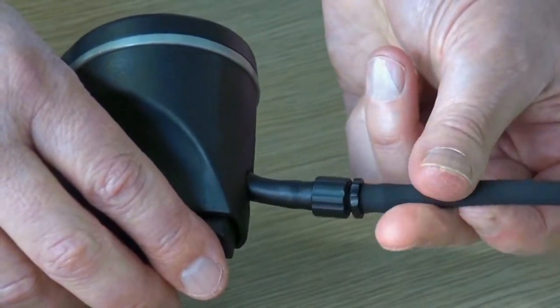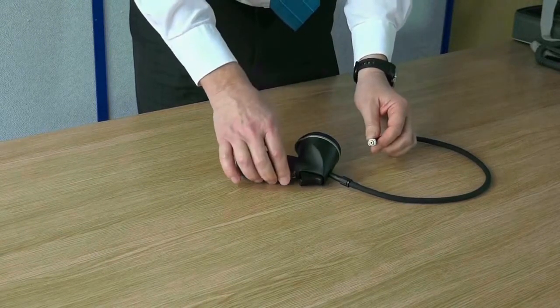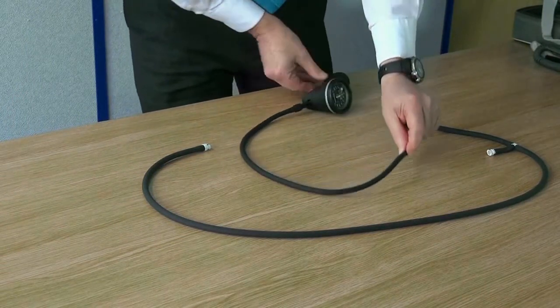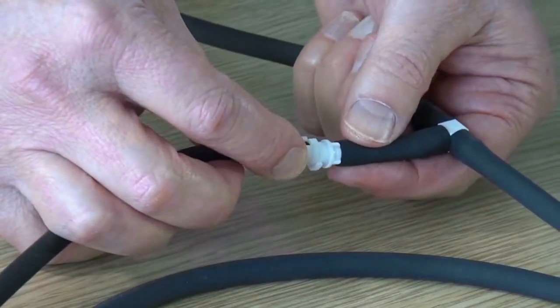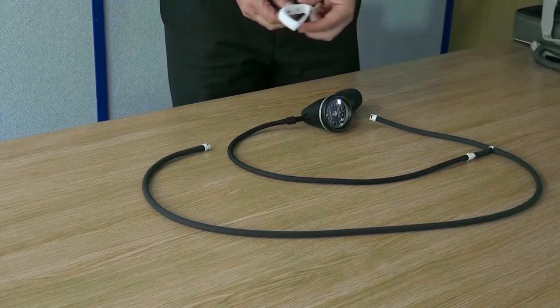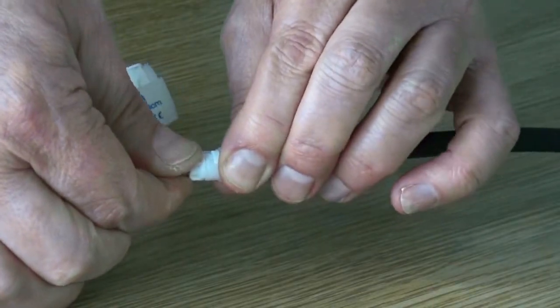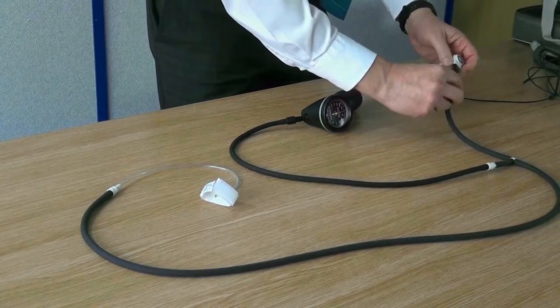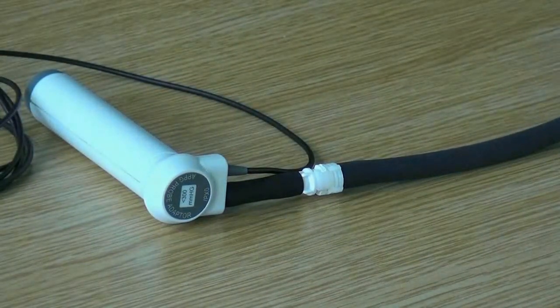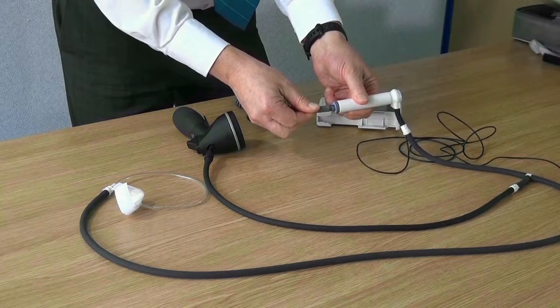Connect the end of the spig to the tube by twisting it into place. Once attached, take the white connector end and join this to the T-tube as shown, twisting them into place until you hear a click. Now take a toe cuff and connect to the longer section of the T-tube. Connect the short end of the T-tube to the adapter. Finally, connect the PPG adapter to the Doppler unit using the curly cable.